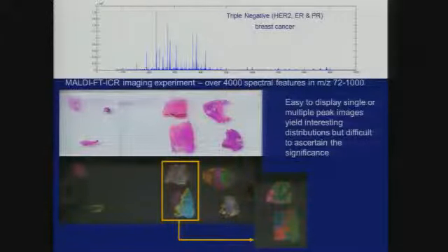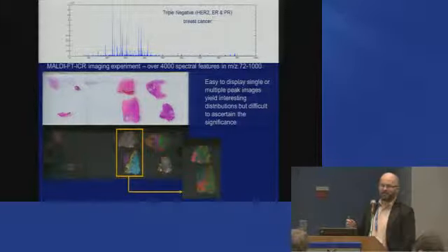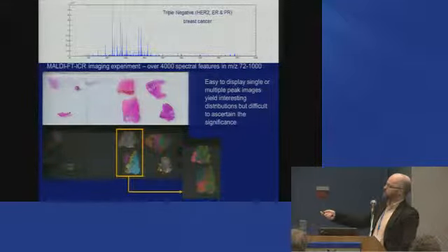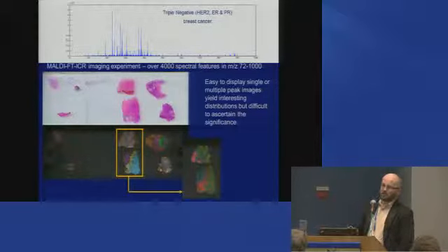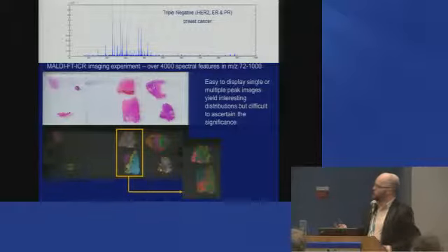So we really had to tune it... what's a nice polite term for this? We have to tune it excessively to get down there, let's say. And if you actually do a very conservative peak picking algorithm, we basically get more than 4,000 spectral features in quite a narrow mass range. And so you have this absolute sea of peaks, and you have to do something about it.